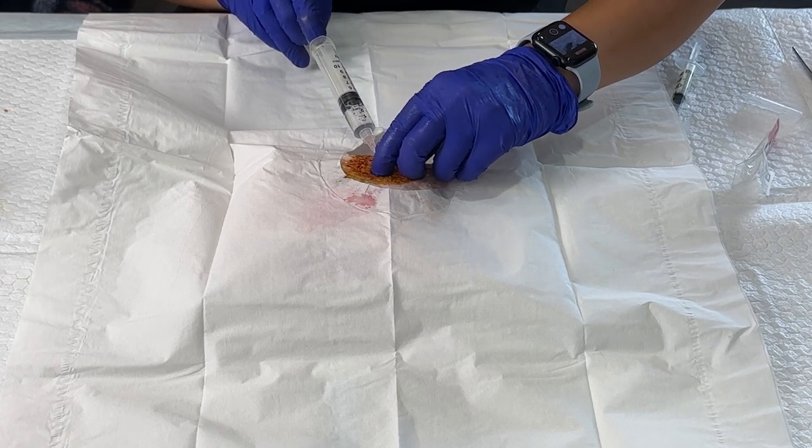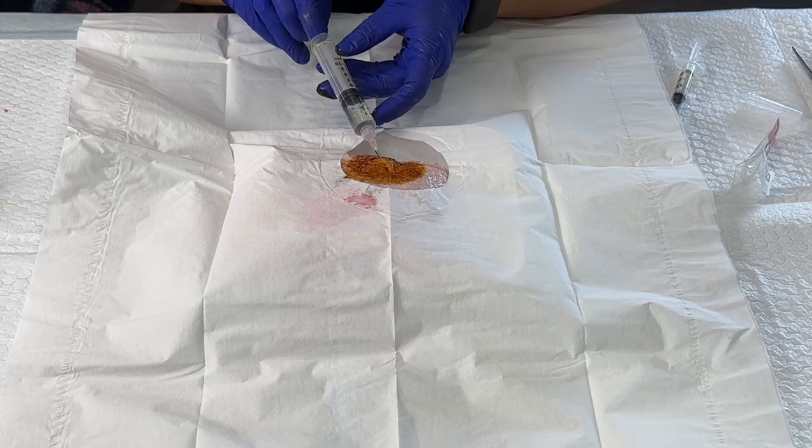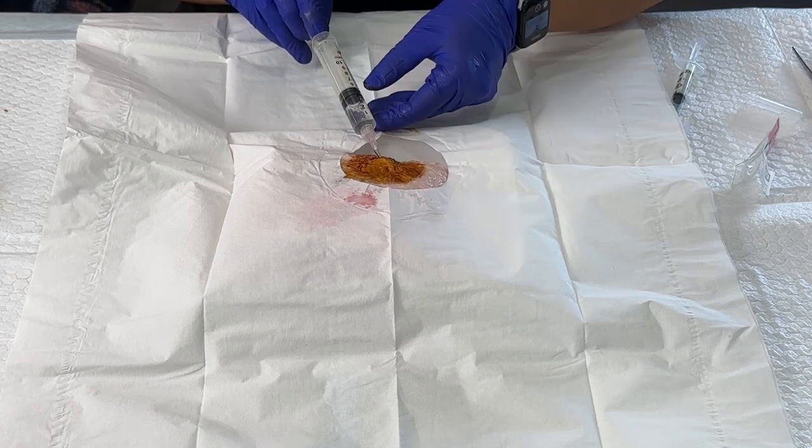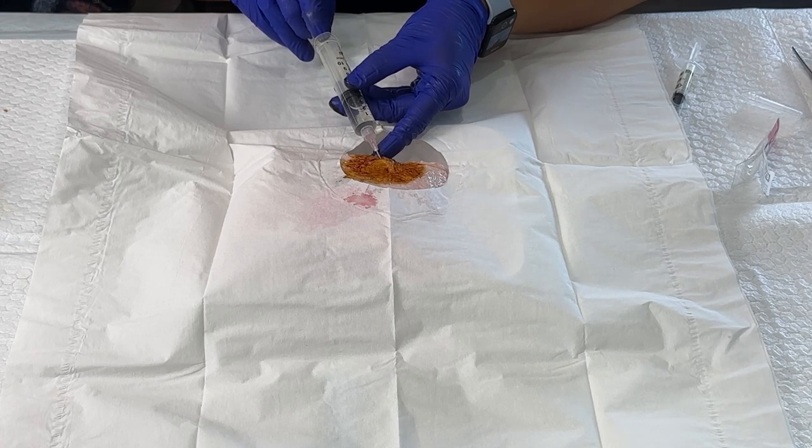And you kind of squeeze a little bit. We have the majority of what was inside of that cyst. And then once we're done with that, we can withdraw the needle.